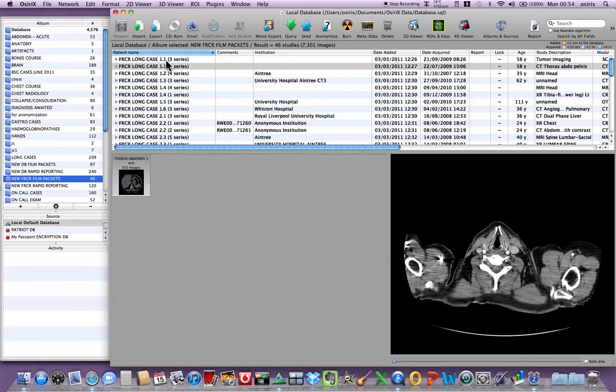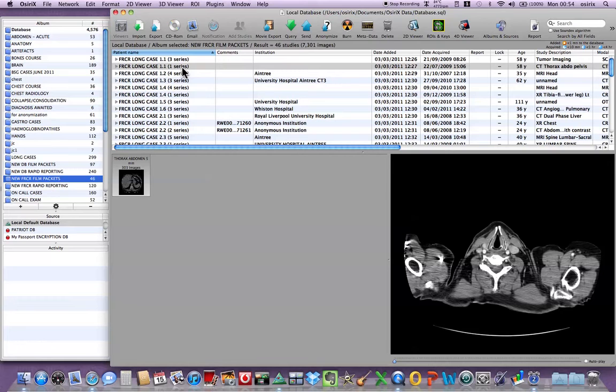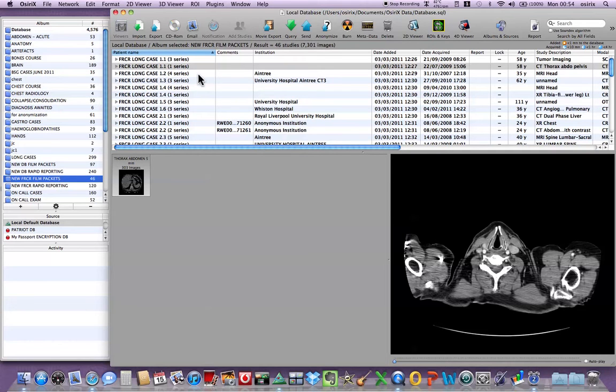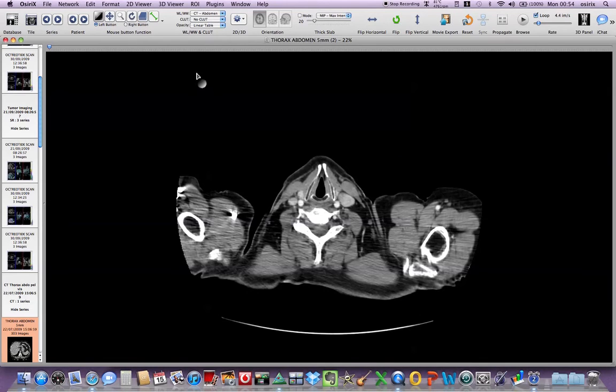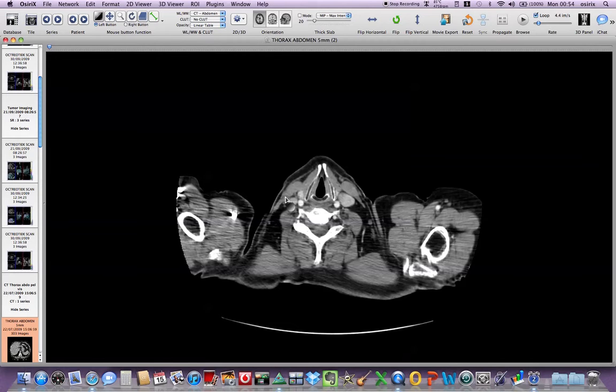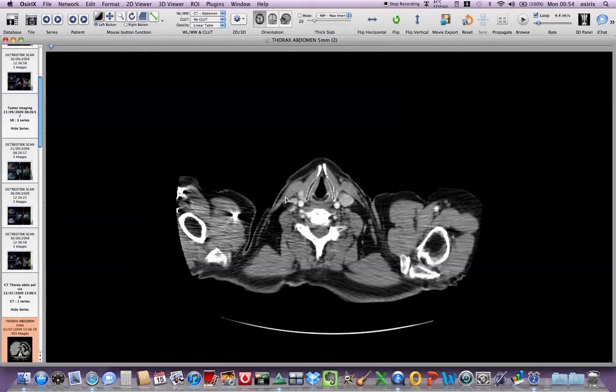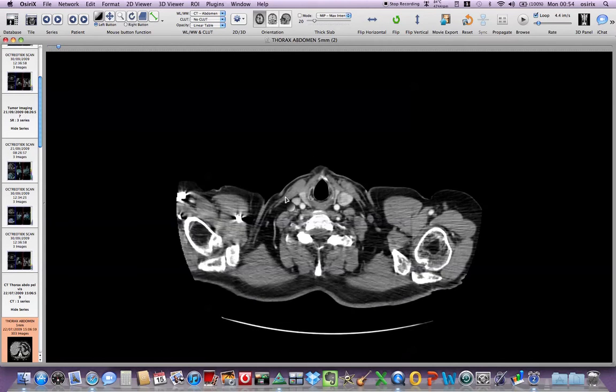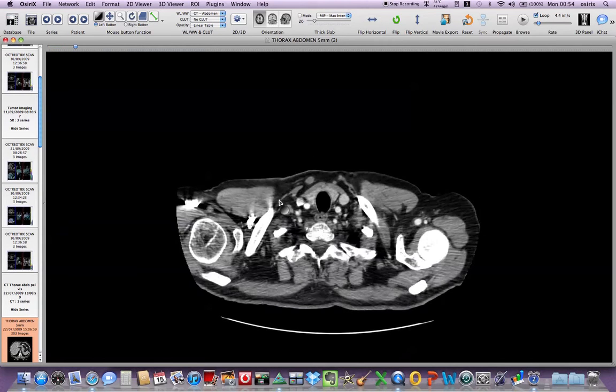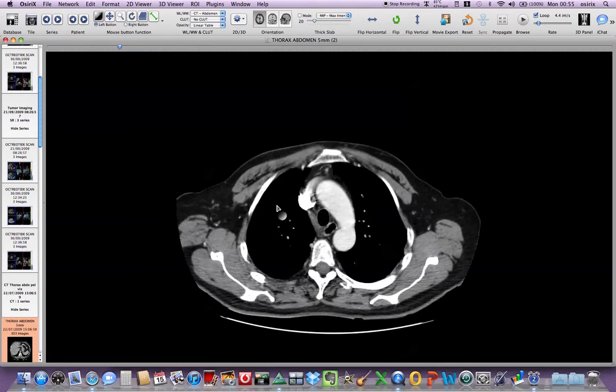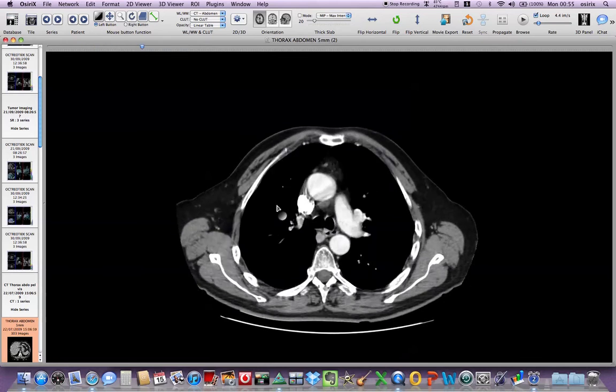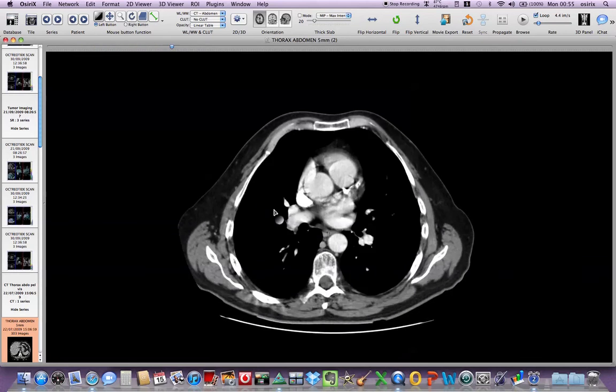So this patient had an octreotide scan and also abdominal thorax and pelvic CT. So if I just go into that you can see that the octreotide scans are there on the left and this is the CT thorax, abdomen and pelvis image. We can use the scroll bar on the mouse to go up and down on the image.